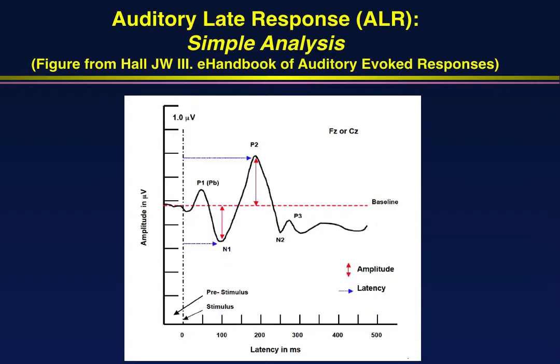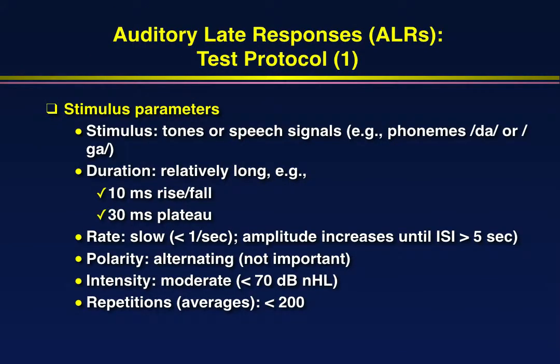Parameters are quite different for the late responses. Now we definitely need to use either tones or speech signals. Many people use speech signals, such as da or ga, and that way you're getting a response that's more closely related to behavioral auditory processing.